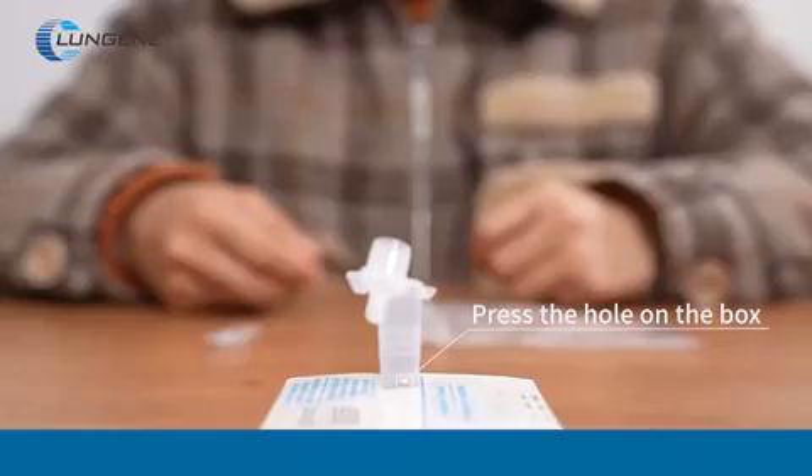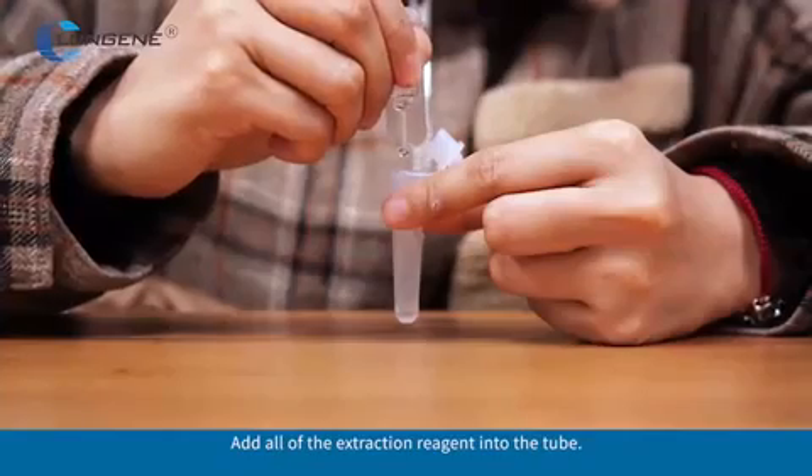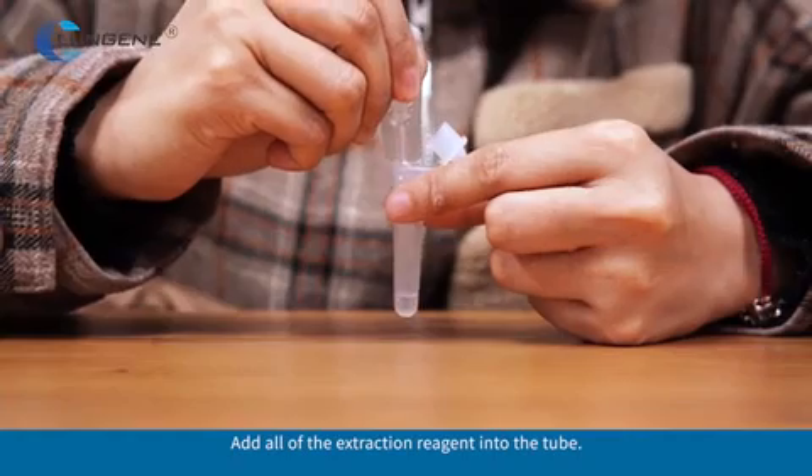Insert the tube into the hole. Unscrew the lid of the extraction reagent. Add all of the extraction reagent into the tube.